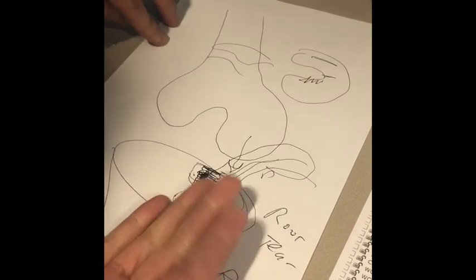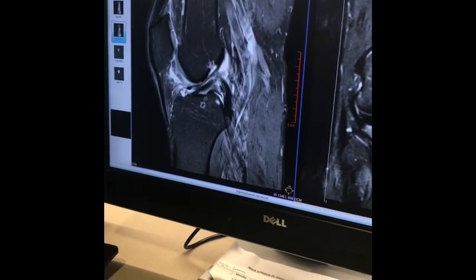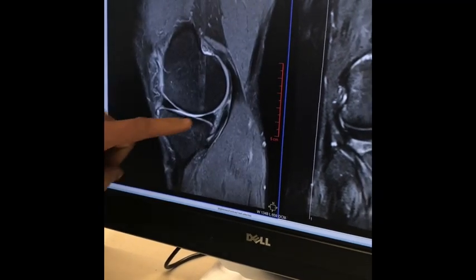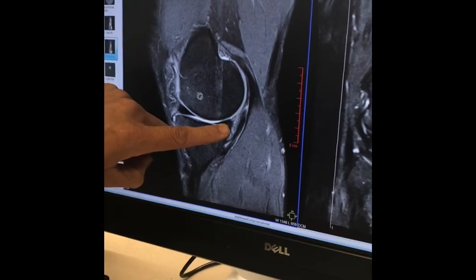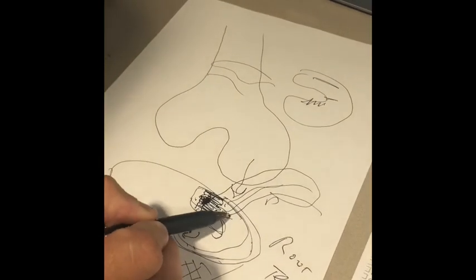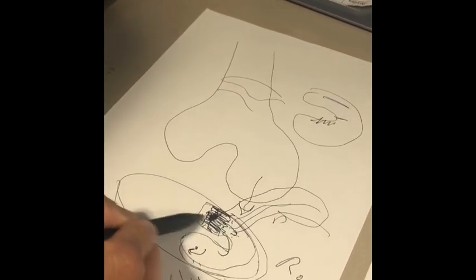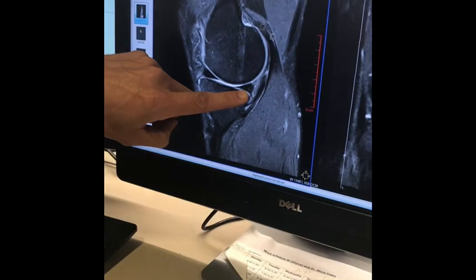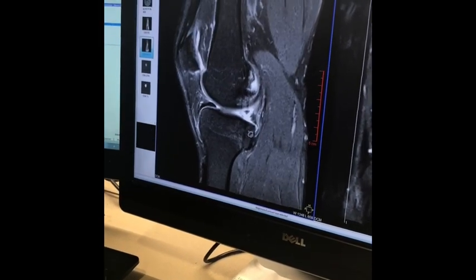Now we're going to look at this side view, which is over here. And if we look at it in the side view, this is actually very interesting too. So you can see the posterior horn meniscus right there. So as we move, this area corresponds to this spot right here where you see it. But now as we move towards the midline, it's going to disappear. So we go over here, and we follow it. Boom, it disappeared. You see? It's not there anymore.